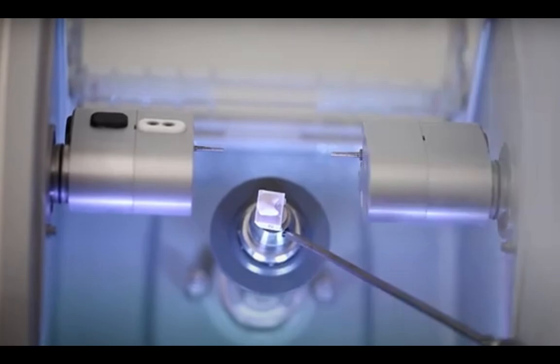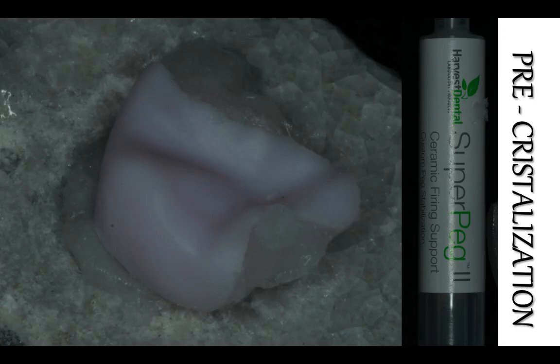Then once the milling is completed, you remove it with a wrench. You place something known as ceramic firing support. This is like sticky white stuff that you place underneath the intaglio of the onlay or the crown, with the intention to support the ceramic so that it does not fracture, and also to protect the whole ceramic restoration.